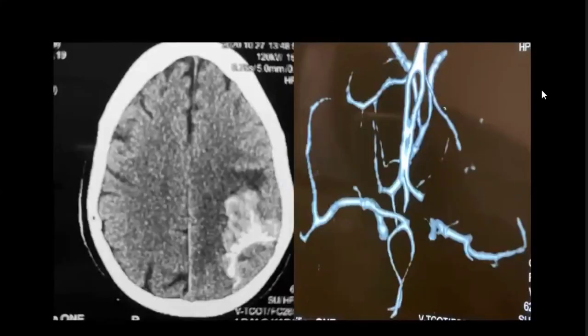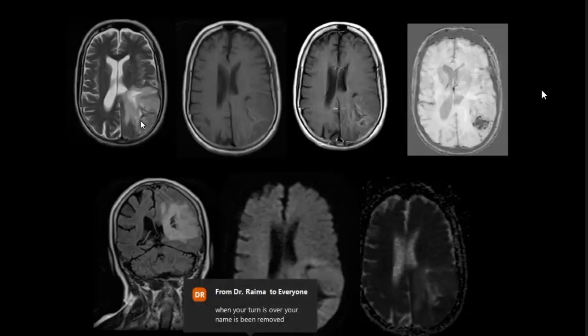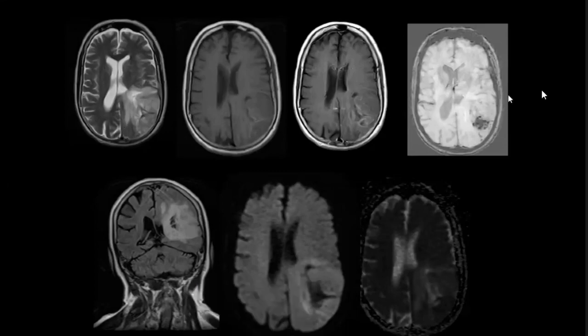So this is the difference, everybody had been asking how we differentiate between calcium and hemosiderin. This is how calcification appears on MR images. You cannot appreciate any specific T2 weighted signals. It's just a vague area, and you can see a vague area of blooming on SWI. That is the reason I kept this case, so that you can compare the dropout of calcification and the baseline signals of calcification on T1 and T2. They are very different from the initial images I showed you regarding cavernoma. It's very different from hemosiderin. So when you keep on looking at images, you keep on differentiating.